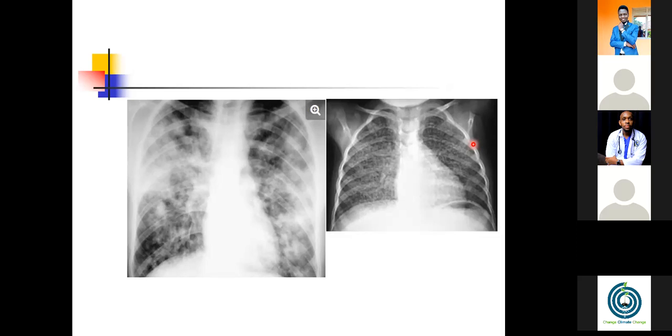It is only when we have given additional contrast in the form of radiographic contrast agents that they become easily visualized. I can easily answer it as that.